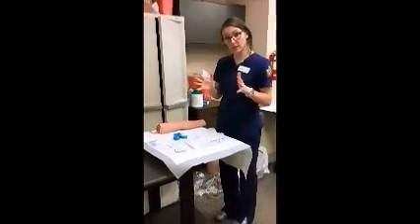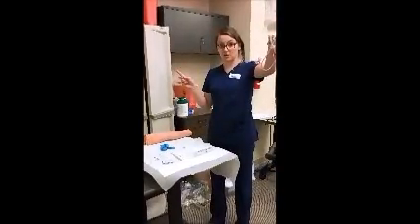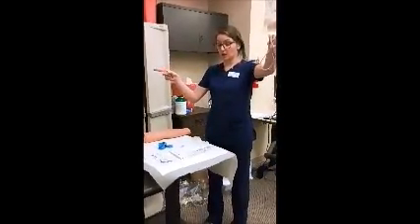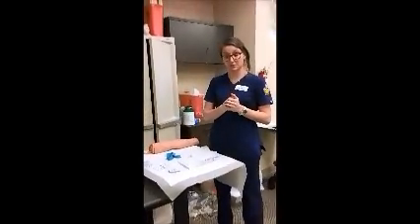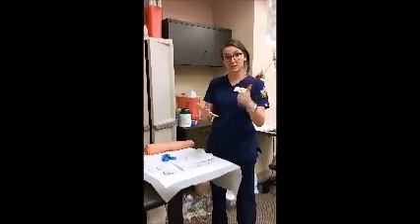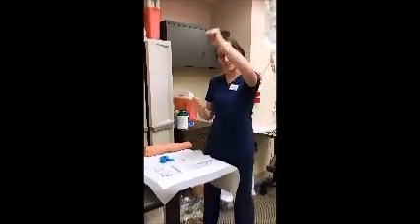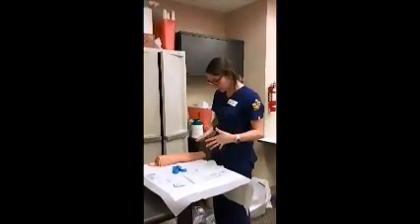So after we get all that out of the way, we will verify our fluid order with the MAR. We would verify our fluid order with the MAR, make sure that is all good using our 6 rights of medication: right patient, right dose, right med, right time, right route, and right documentation. So now we would get stuff set up here.